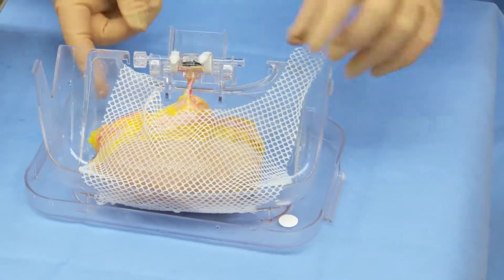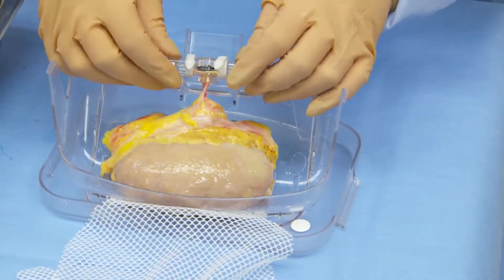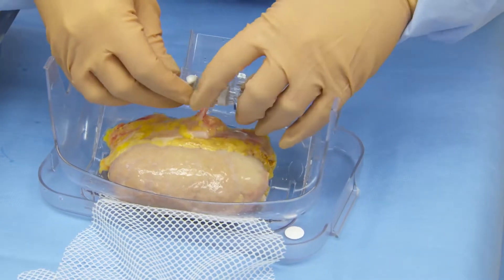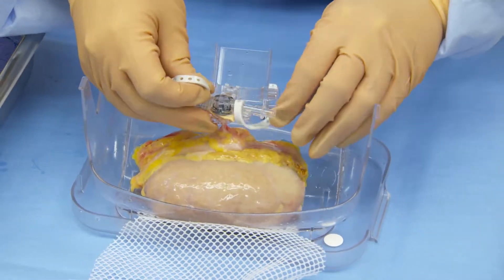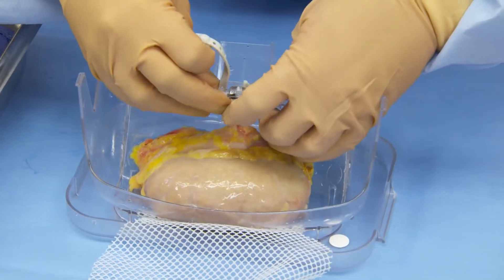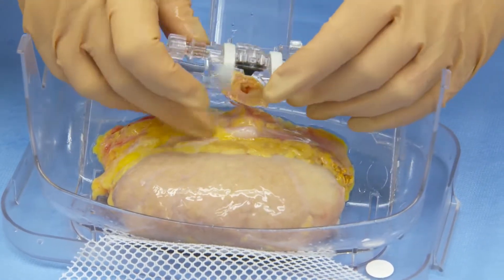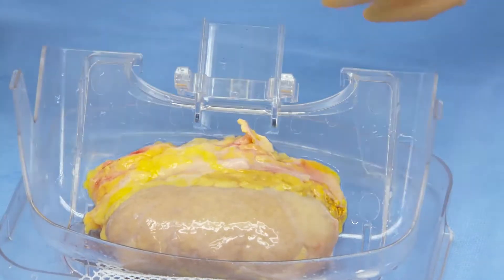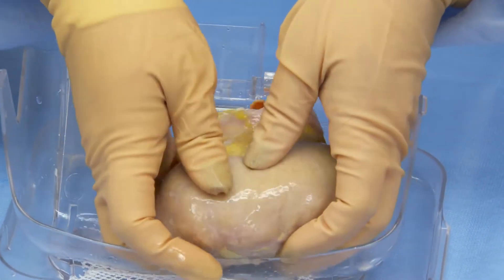At the back table, open the mesh organ restraint, remove the cannula from the cannula mount, and then remove the cannula from the vessel. The kidney is then ready to be removed from the kidney cradle.